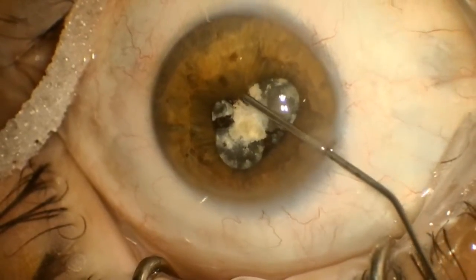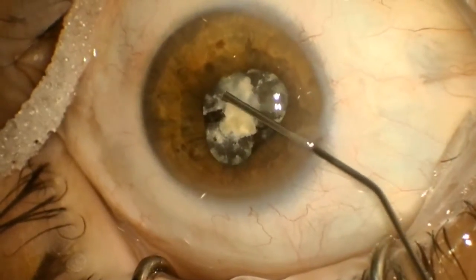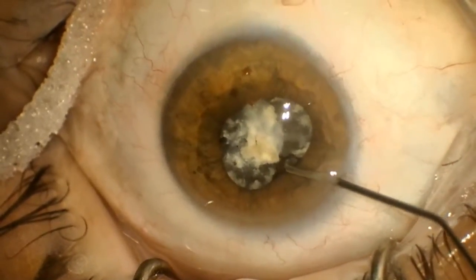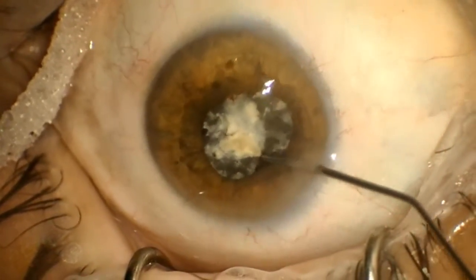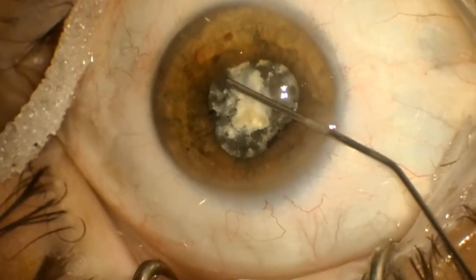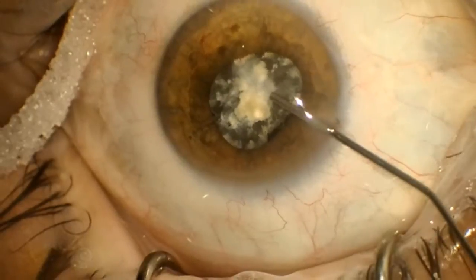As you can see, we have posterior synechiae attached to the anterior lens surface. You may also be able to appreciate that there is some zonular instability, as the iris and the lens are moving somewhat independently with these minimal manipulations.